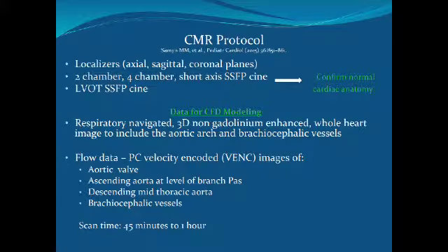And our MRI protocol, I know some of this may be Greek to you, but the first part of it, just suffice it to say, was to confirm normal anatomy. My IRB said to me, how do you know these diabetic kids are really normal? And so they required that we did a clinical scan to show them anatomy is normal.